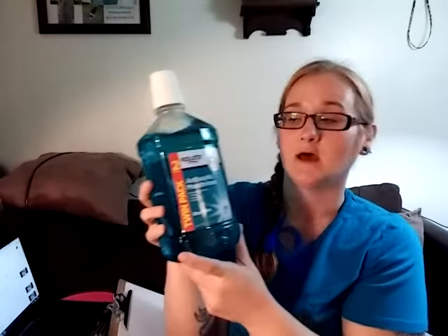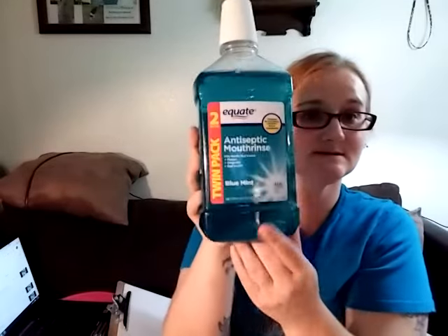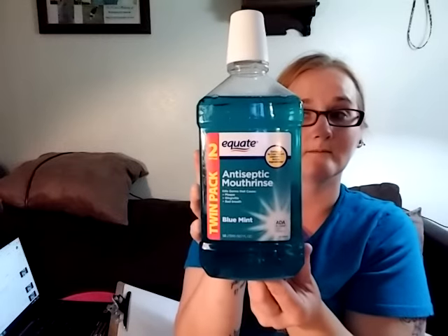So first thing that I do, I use Equate antiseptic mouth rinse every day. First thing I do when I get up in the morning, I use that to rinse my mouth out, and I also use it at night, because since I use adhesive, that helps get any adhesive that might be stuck in my mouth out. It also helps with bacteria that would be in my mouth, just like if you had regular teeth. I use it, like I said, in the morning and at night.